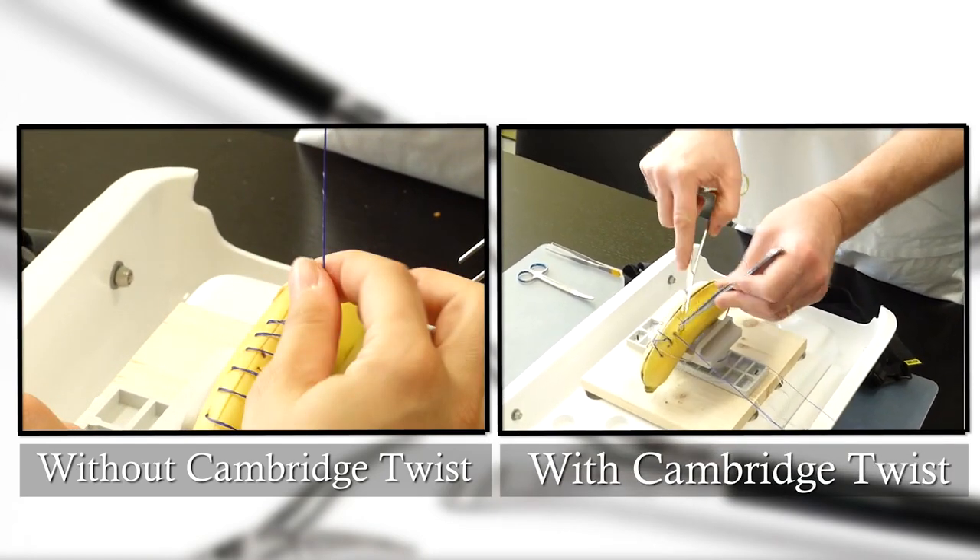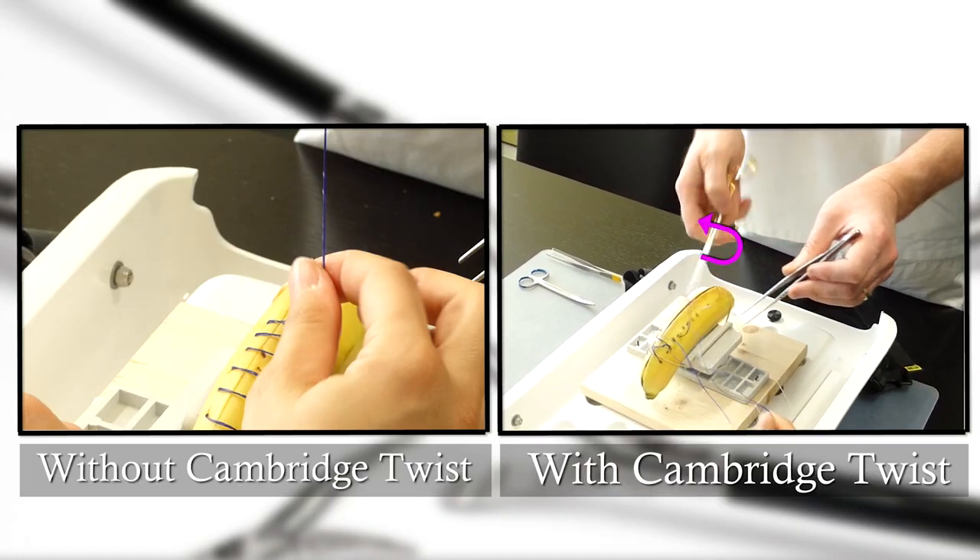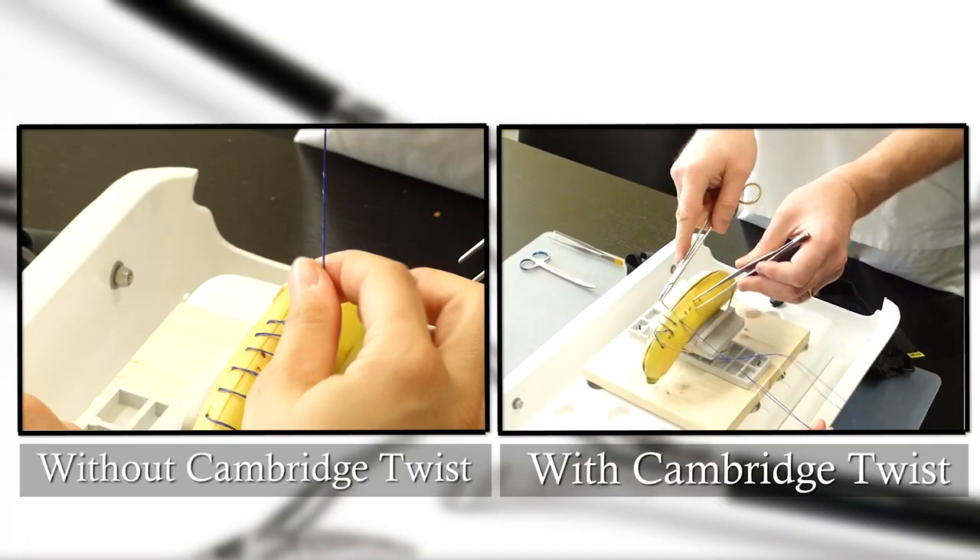On the right side, one can observe that the running suture falls down smoothly without any need of the assistant to interfere.